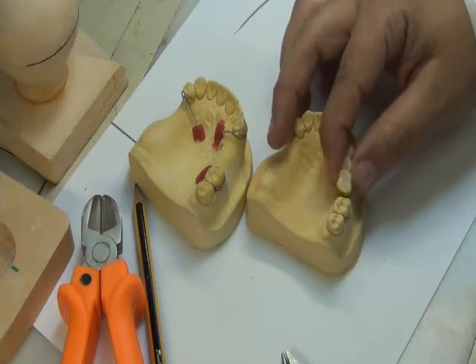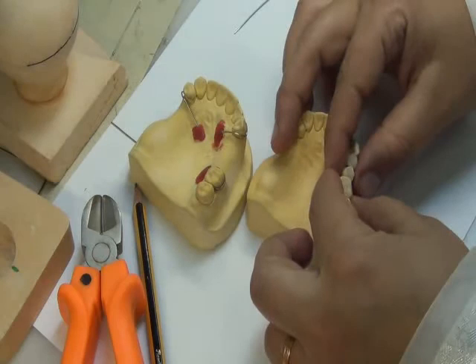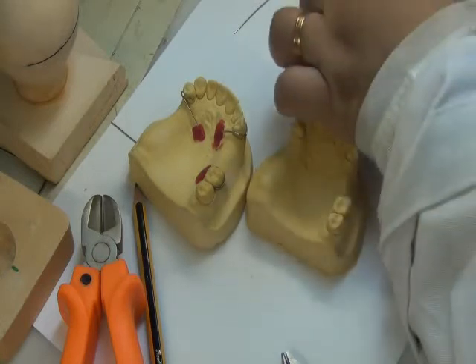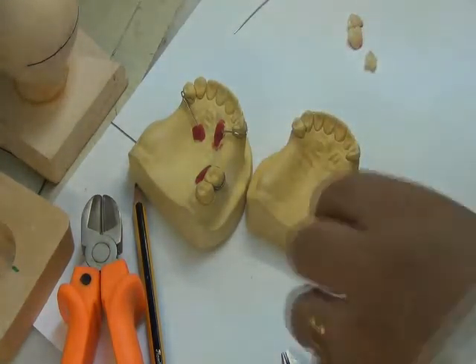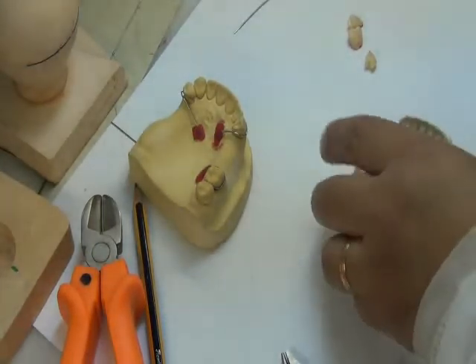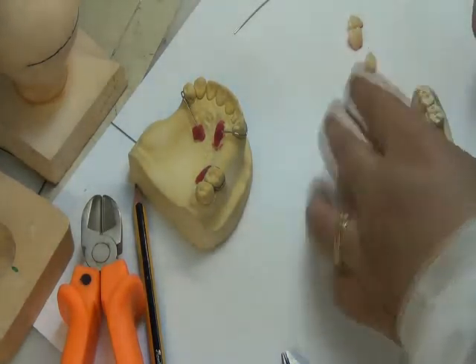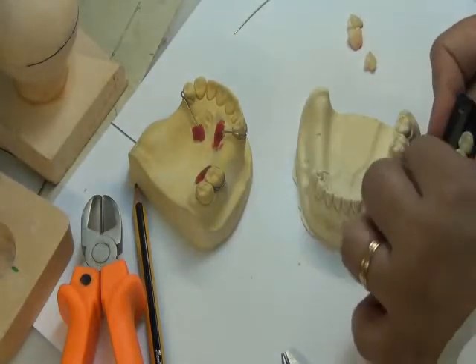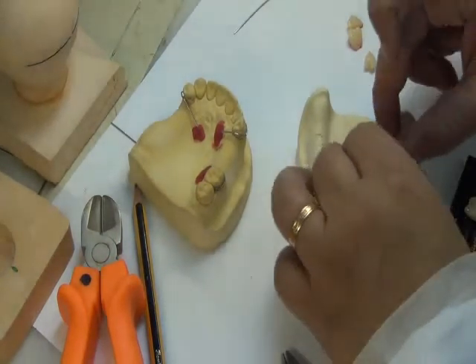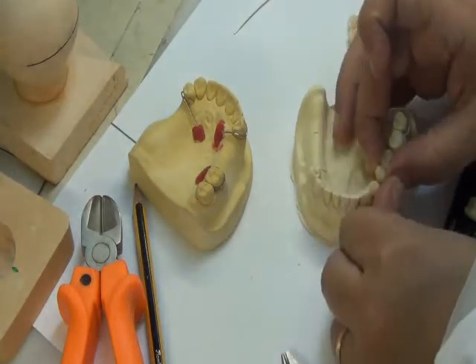So this is okay. The other situation is when you have smaller teeth. Suppose that I'm coming in with a size, and when I place it, I'm going to choose this one, for example. This is the lower cast, and I want to fit in these teeth in place. I'm going to go for the bounded saddle area, and I try to fit in these teeth, and I find that, suppose I'm using this size, and I find space.